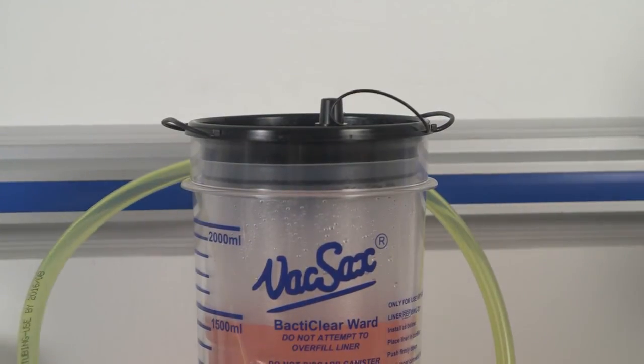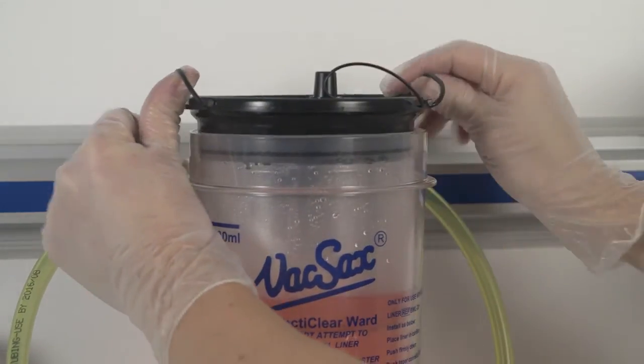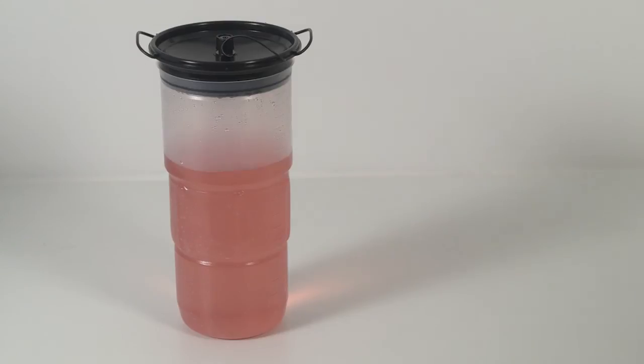Remove the vacuum tapered connector from the top of the liner, remembering that there is no requirement to cap off the vacuum port. This is due to the hydrophobic filter located within the liner itself. Using the convenient handles located at the sides of the liner, remove the liner from the canister. The VacSax BactiClear antimicrobial liners stand upright when full of fluid for convenient and safe disposal.